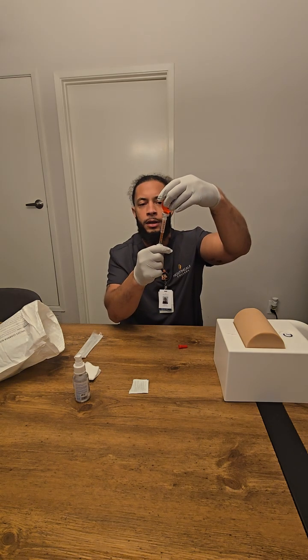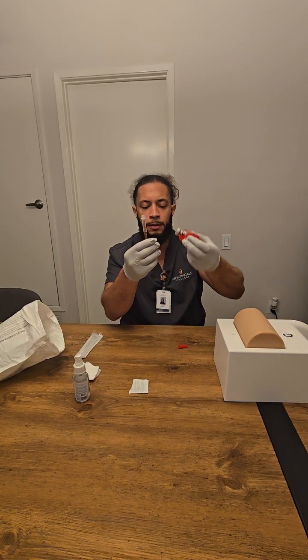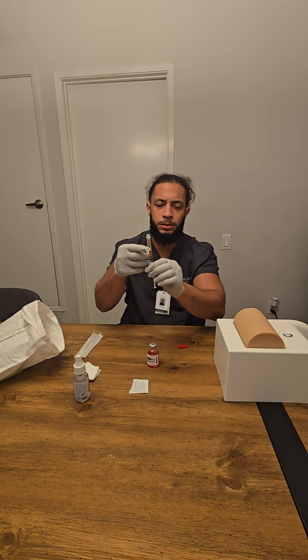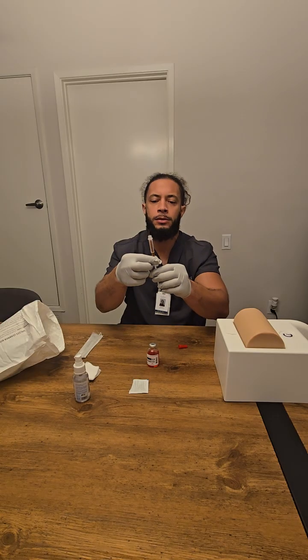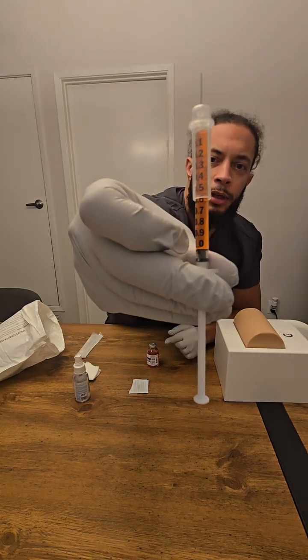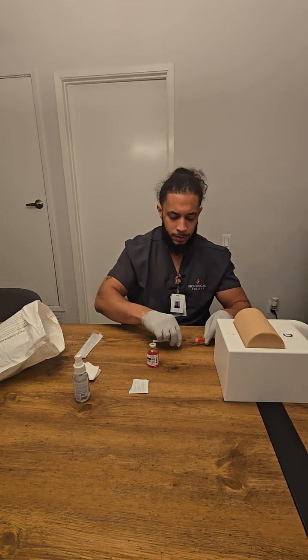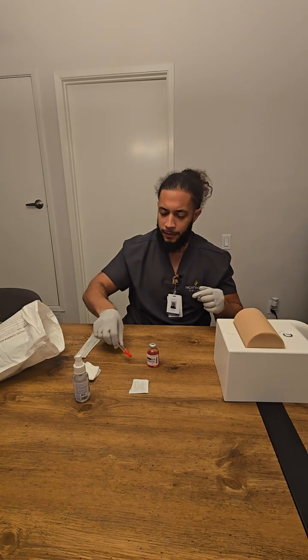All right. Take out any air bubbles. Bring it to the camera. Can you see it's 1 mL? All right, now do the one-handed scoop and cap my medication. All right.